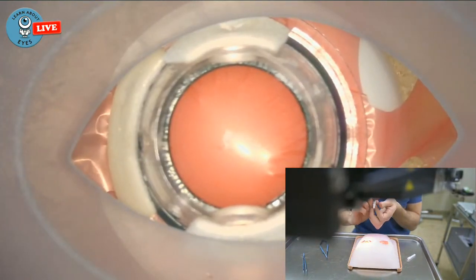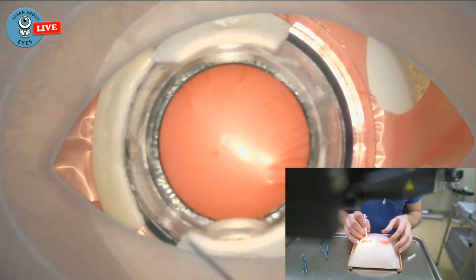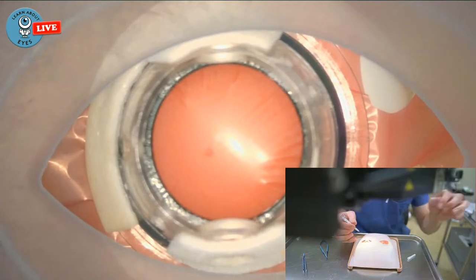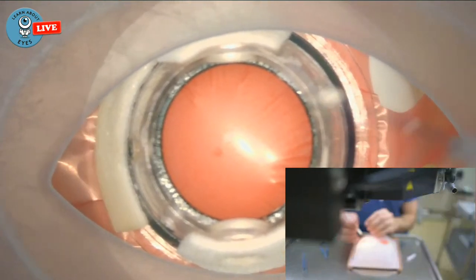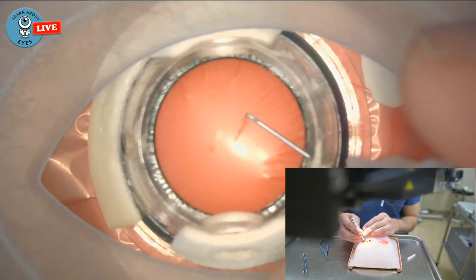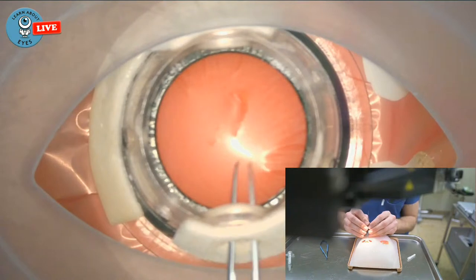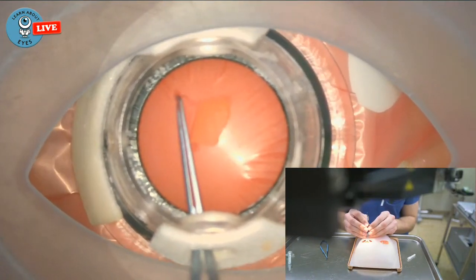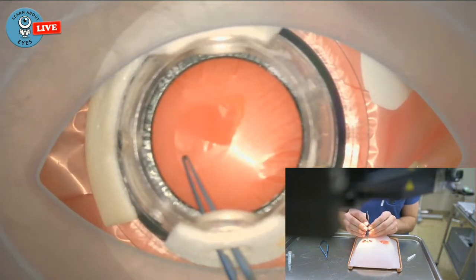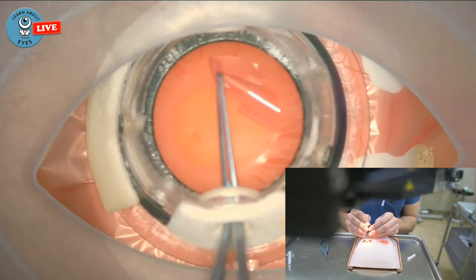Okay. So, of course, you would have already done the incision here, and this is supposed to be the paracentesis, at least from what I understand. Let me just take. I think you can see it. It's okay like that. So, if you want to practice it like that, you can incise the capsule a little bit, and then what I do is I use a forceps usually to get to the size that I want. You can practice your pivoting here. Maybe not perfectly round right now. There we go.